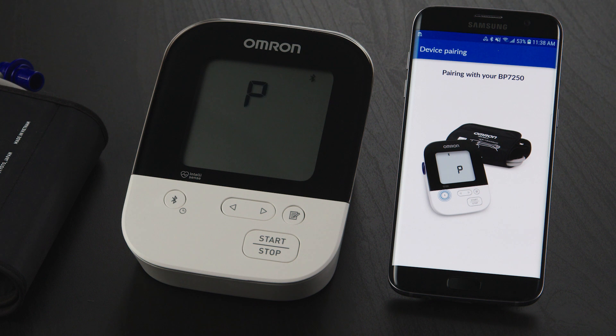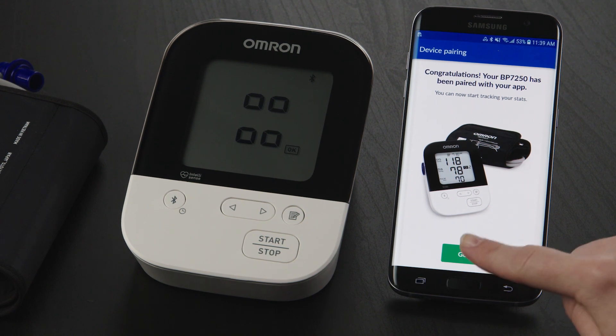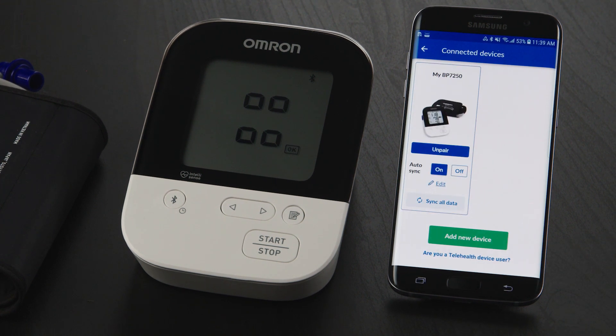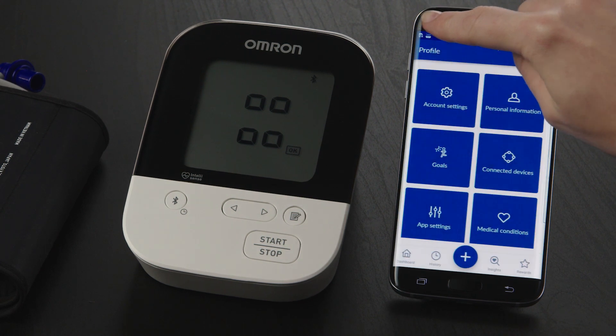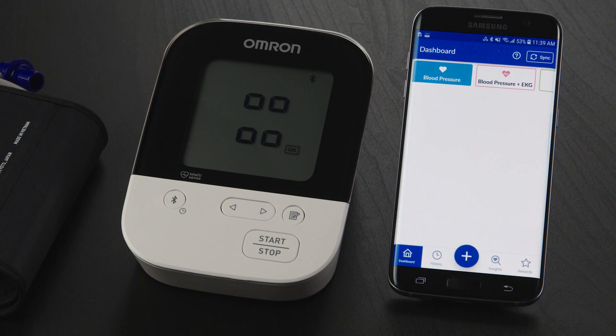When pairing is complete, the display on your Omron device will flash and you'll receive a confirmation message on your phone. Tap the Got It button. Then tap the Back button in the upper left corner of the screen, and tap on the Dashboard icon in the lower menu to return to the Home screen.